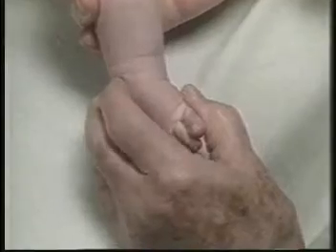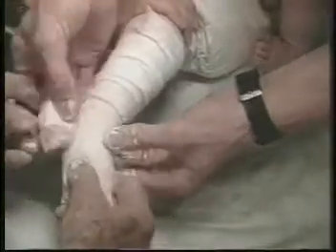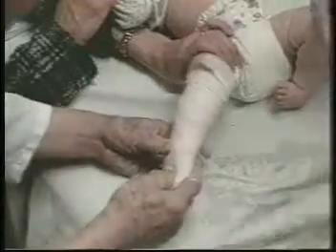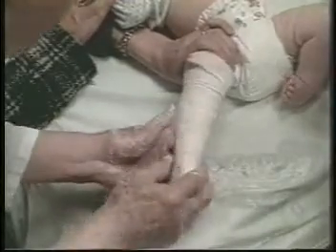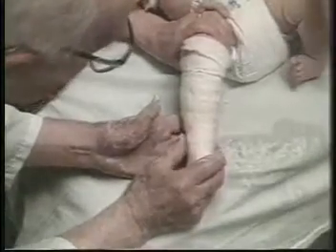The forefoot is abducted in supination, while my index finger is applied on the head of the talos. A two-inch-wide roll of plaster bandage is applied over the layer of cotton. The plaster is molded at every turn following the contours of the foot. The forefoot is abducted in supination, while the thumb applies counter-pressure over the lateral aspect of the head of the talos. The thumb continually smooths the plaster over the talos head. The plaster is extended to the upper thigh.